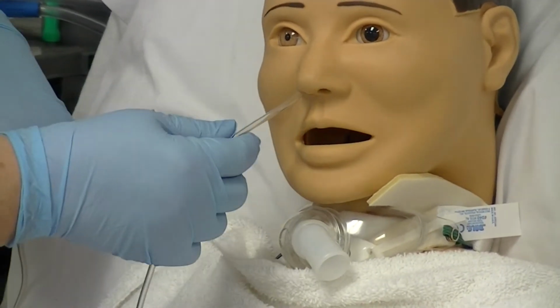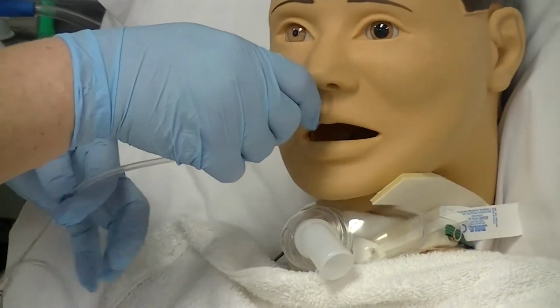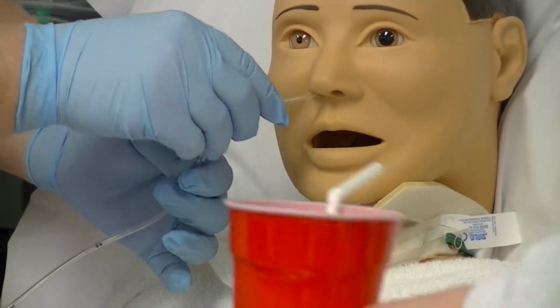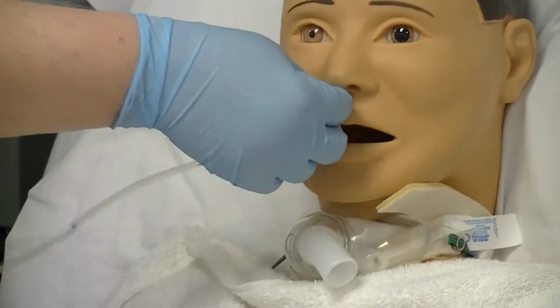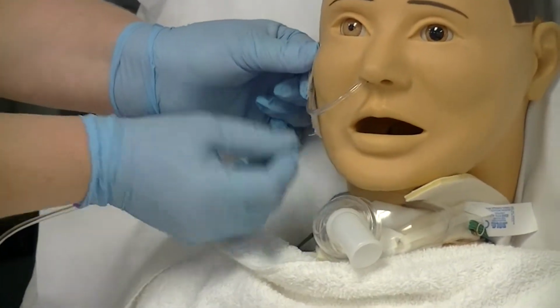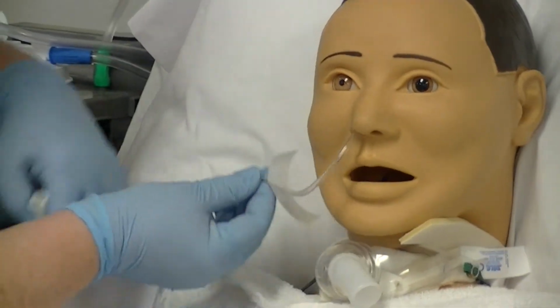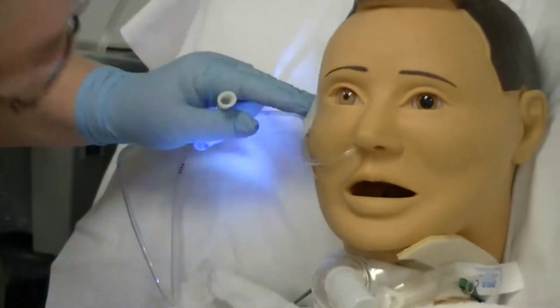Continue to advance the tube with each swallow until the tape or marker is reached, at which time you will temporarily anchor the tube to the client's cheek. You're going to check for placement of the tube by asking the client to talk. Tell me your name and date of birth. Mr. Jones, 31053. Inspect the posterior pharynx for presence of a coiled tube.